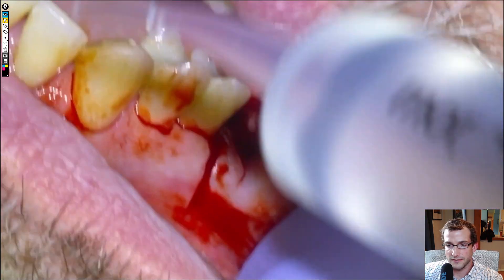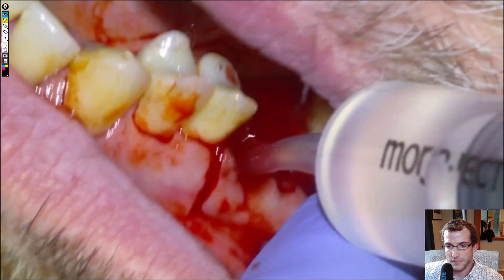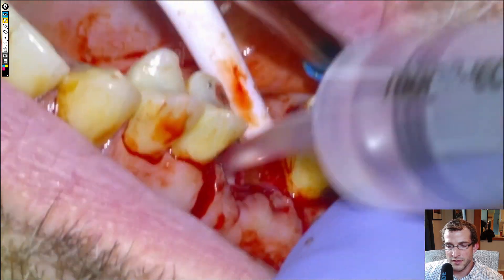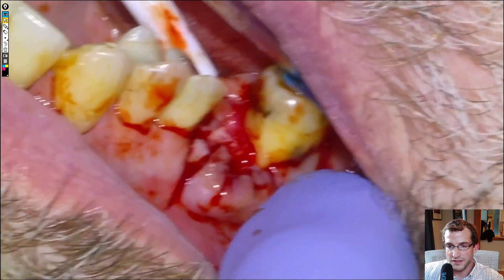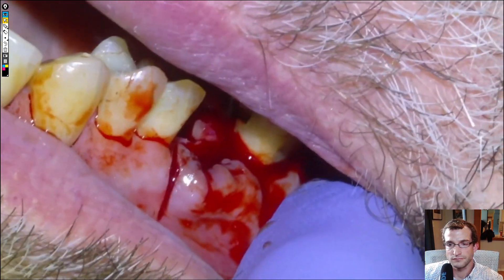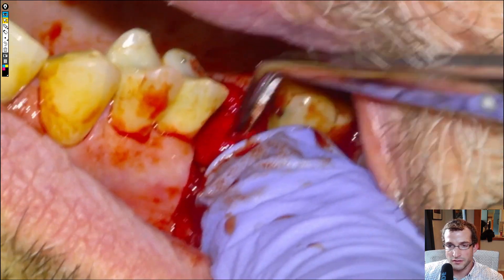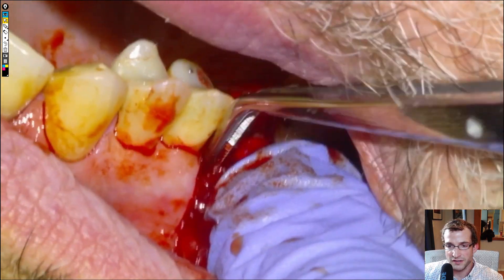We'll grab the bone file and just work it down flat until it's smooth to our thumb. Then we'll irrigate with sterile saline, and put some gel foam into each of the root sockets — one into the palatal and then one shared between the buccals.